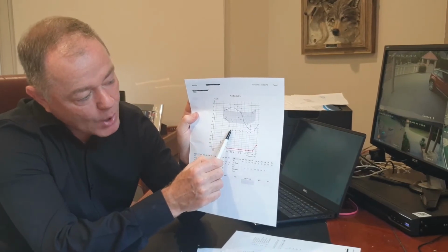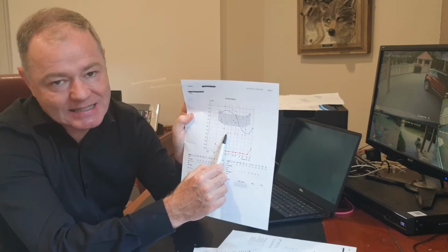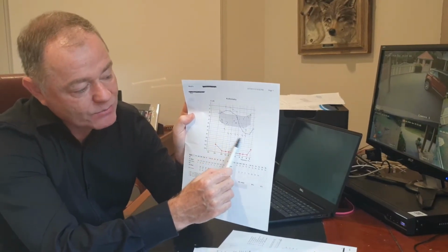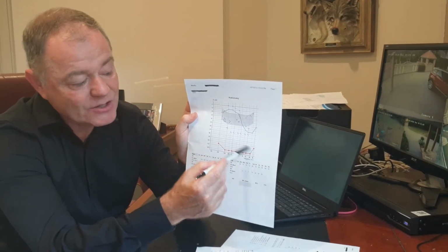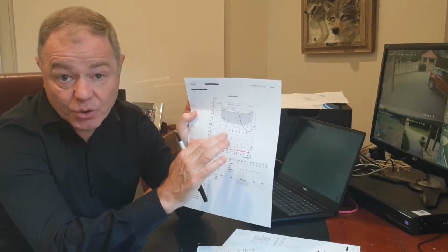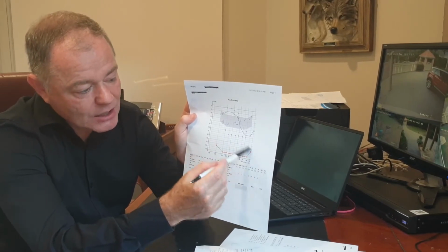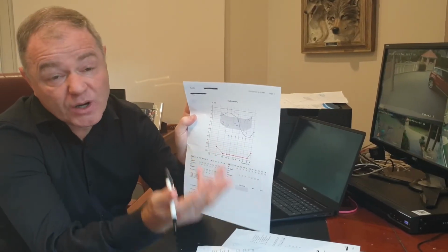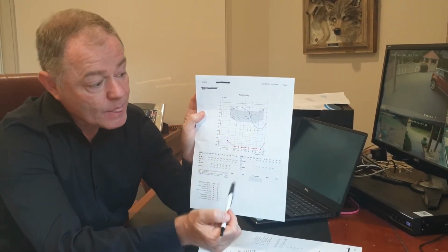And when we did the bone conduction test, we can only test down to about 70 decibels on that test, and at that level there was no response. So basically this would be an ear that a hearing aid would have no chance of being able to correct. So this client could do one of three things. They could wear just a single hearing aid in the left ear.